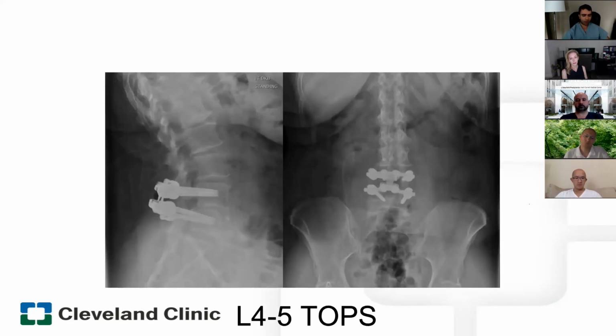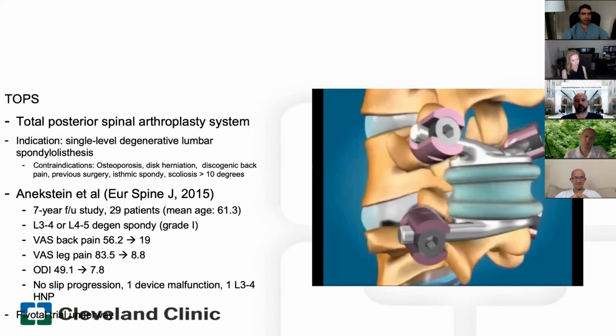So now, what we did was something called a TOPS, so L4-5 TOPS. What TOPS stands for is a total posterior spinal arthroplasty system.